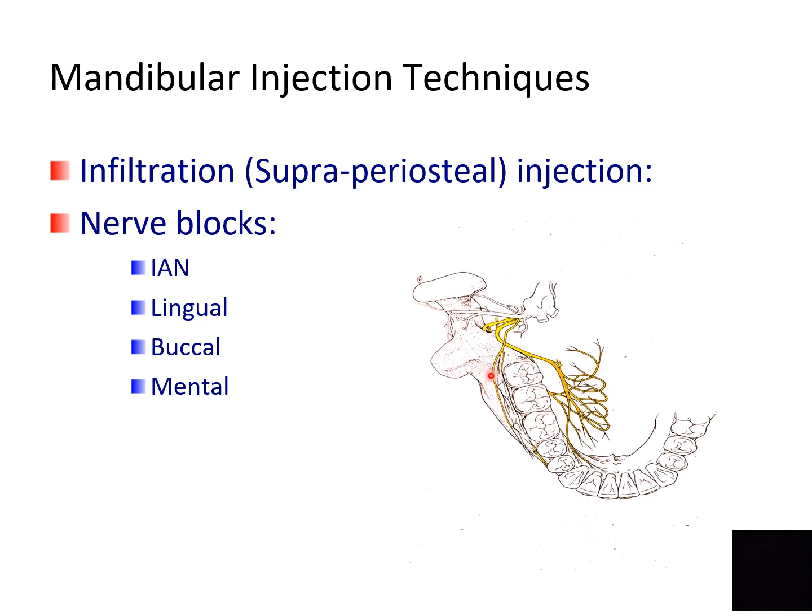So anesthesia of the buccal soft tissues in the mandibular molar region can be accomplished by a buccal infiltration alone, or if you want to anesthetize a larger area, that is, if you were to extract two or more mandibular molars, you can also use a long buccal nerve block, which would anesthetize all the buccal soft tissues posterior to the mental foramen. You also require anesthesia of the lingual soft tissues related to the mandibular molars and premolars for tooth extractions.